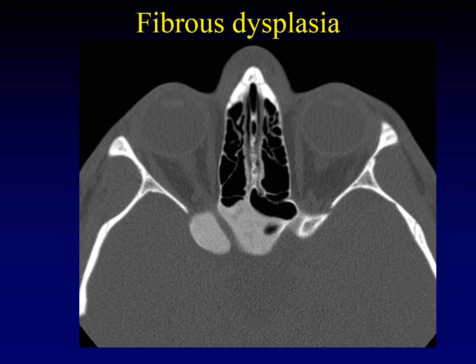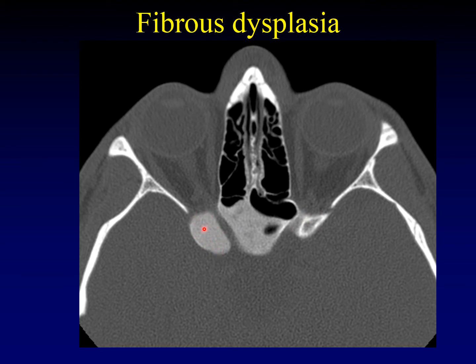Fibrous dysplasia is the disease classically described as having a ground glass density. This is the density that has been likened to the ground glass you see on shower doors. The key thing about fibrous dysplasia is that it is expansion of an underlying bone, and that bone expands but retains its normal configuration. This is the anterior clinoid process on the left, and this fibrous dysplasia lesion still has the same configuration as the anterior clinoid process.